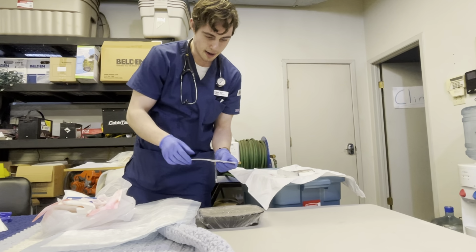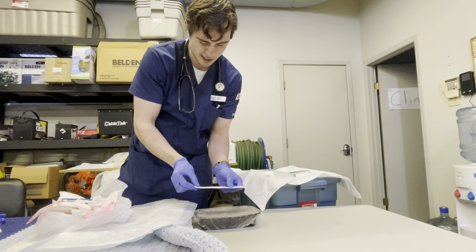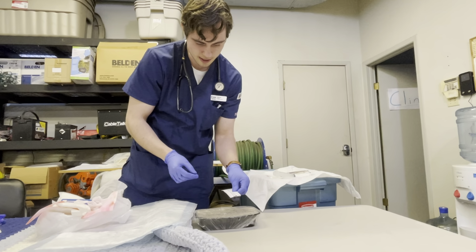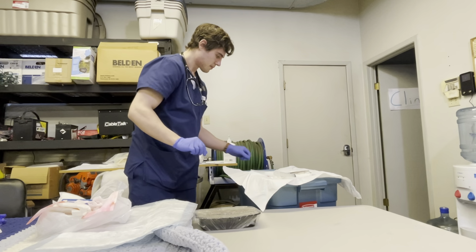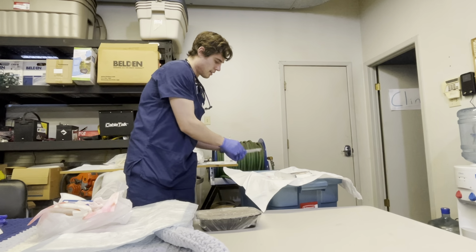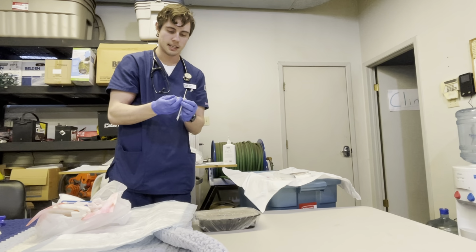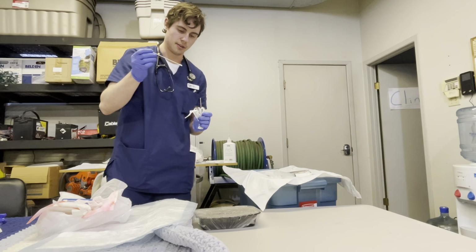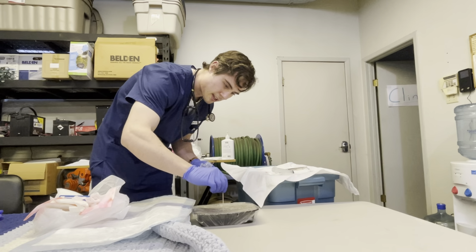So I'm going to assess the wound now that we can see it. So we have here, the wound is about 13.5 centimeters long by 2.5 centimeters wide. I'm going to get a couple Q-tips, wing back the package, open it up, maintaining sterility, and pull out a Q-tip. I'm going to measure the depth.